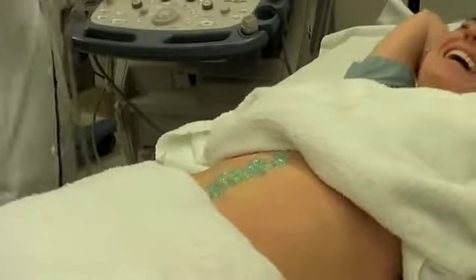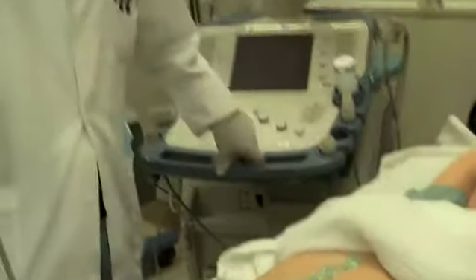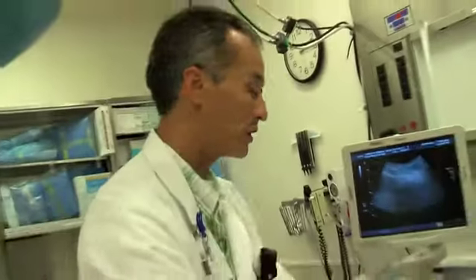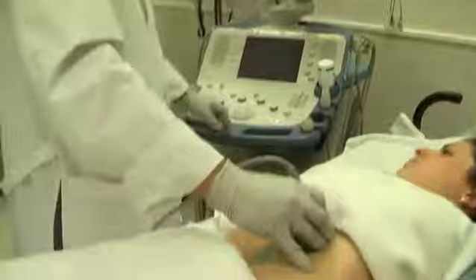Again, this is one of those critical points where you have to know where the probe indicator is in your hand and the screen indicator that is on your monitor here. The aorta and another vessel that resembles it very similarly, called the IVC, run parallel to each other, and having these flipped would not be a good thing. So I'm going to start again with the indicator toward the patient's right. The very first thing I'm going to look at is that my screen indicator is set. I know where my probe indicator is in my hand.